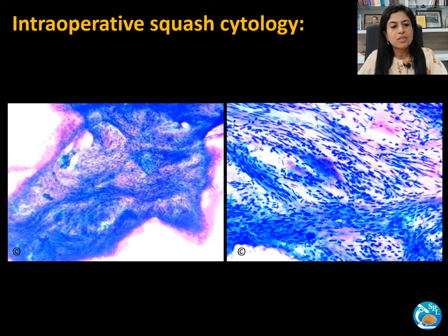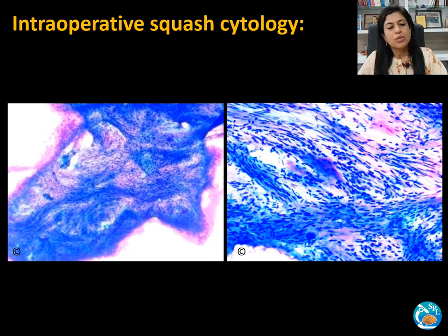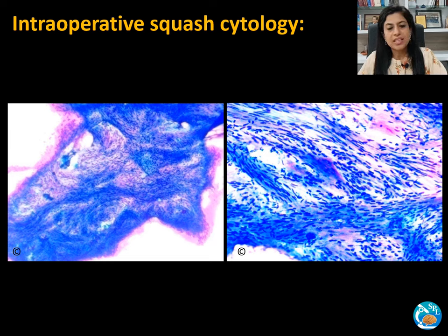This is the intraoperative squash cytology of case one. The smears are cellular and you can see the neoplastic spindle cells arranged in bundles and fascicles, leading to a twisted rope appearance. The cells are elongated with tapering ends, which is typical of Schwann cells, and these have a moderate amount of cytoplasm.